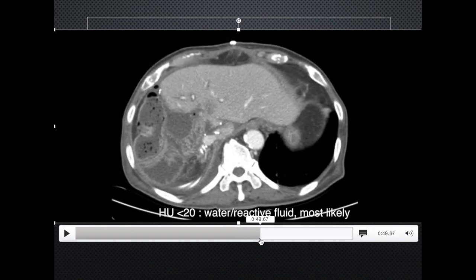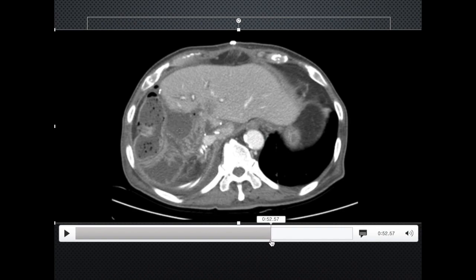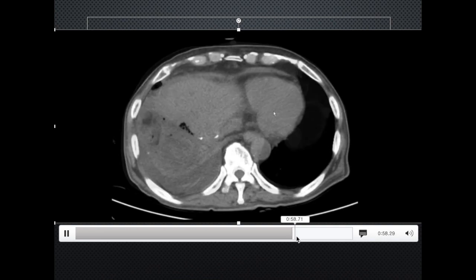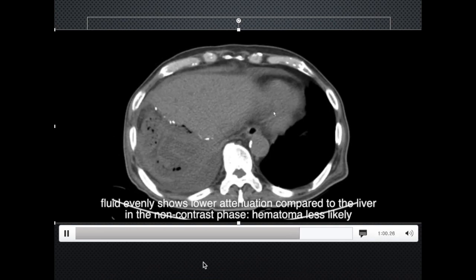Fluid collections can be assessed to determine whether they represent hematoma. Most often, if the Hounsfield unit is less than 20, it is fluid — reactive fluid is more likely than hematoma. It can also be checked in the non-contrast phase. Since the fluid here evenly shows lower attenuation compared to the liver, hematoma is less likely.